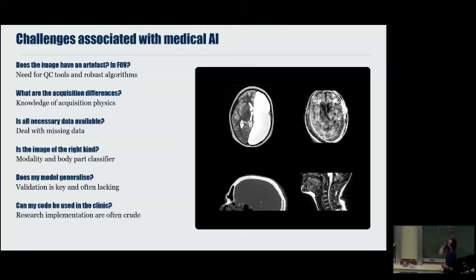So you can see on the top left that one hemisphere is missing. It's been replaced by liquid. You've got heavily artifacted images. Then you've got a lot of movement artifacts. Then you've got even CTs. And on the bottom, you don't even have a brain anymore. You've got the cervical area. And we've had images of arms, legs, and all of that.